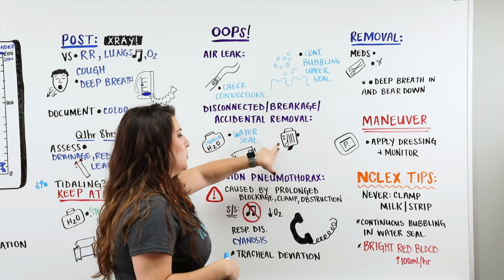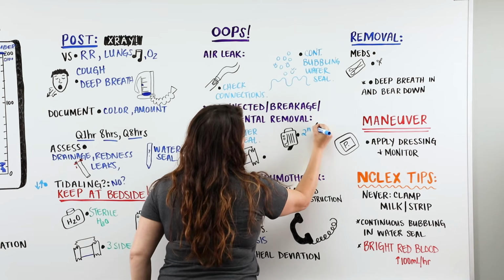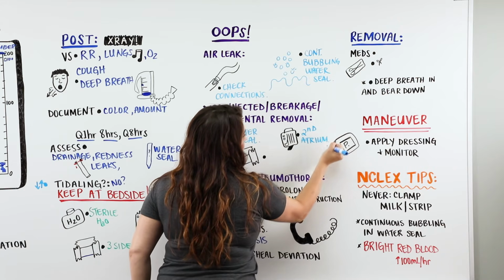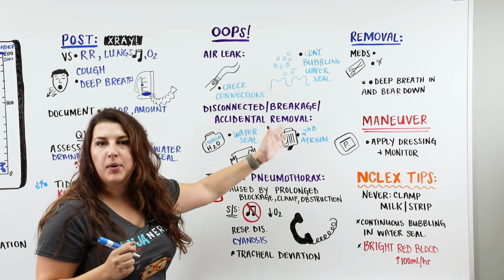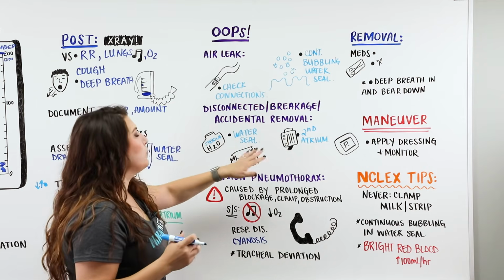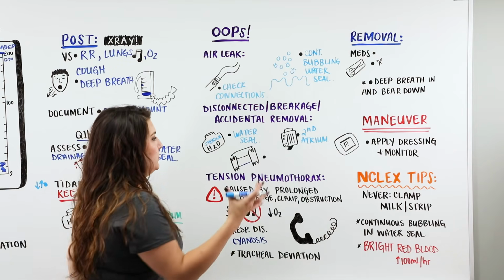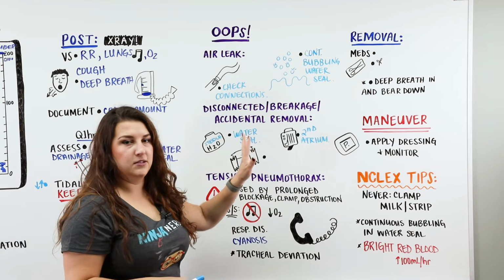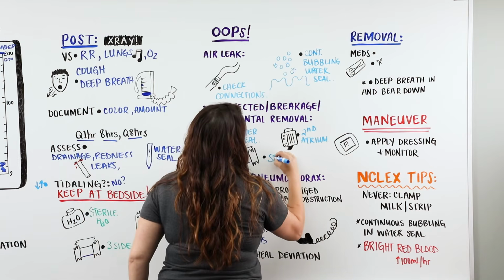Is there a breakage? So we're always going to have a second atrium at bedside, right? Just in case we have a breakage. So something happened, someone knocked this over, someone bumped this, someone hit this, it got cracked, there's a break somewhere, or it's totally full, and we need to change it. We're going to put that second atrium on, just going to disconnect and reconnect right from that nice little connection point. And the last thing is our sterile gauze.